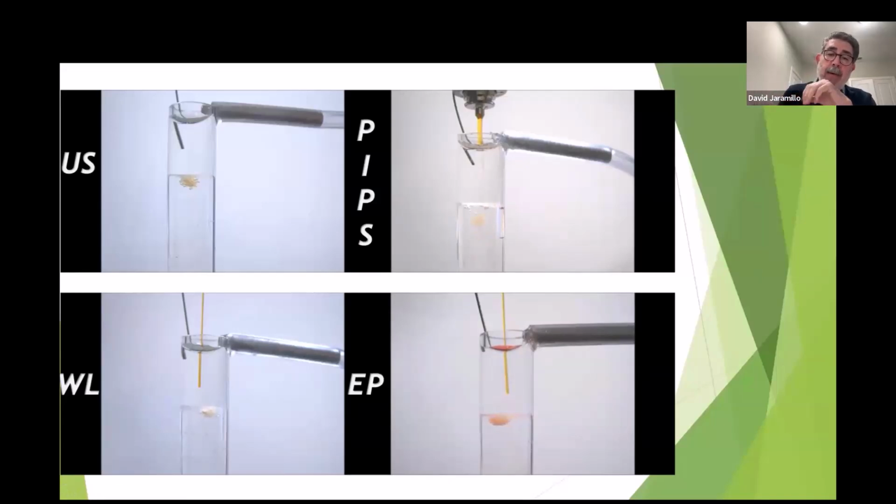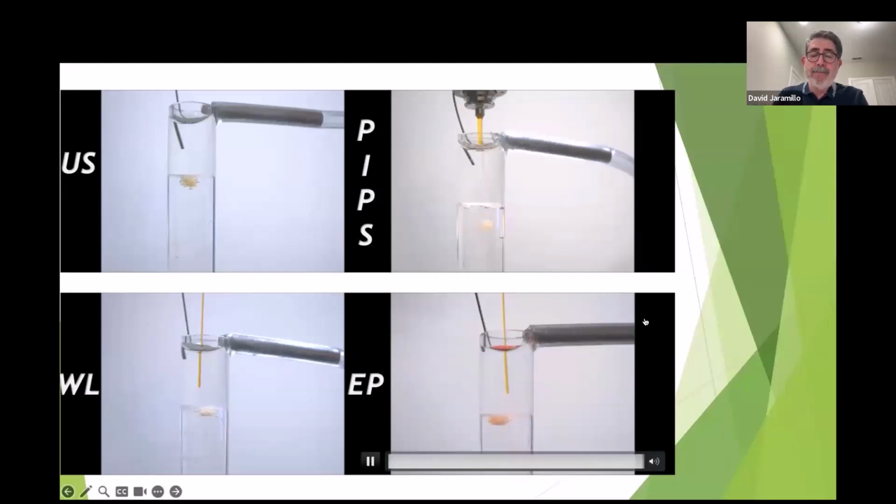Somebody posted a video on Facebook of a glass of water with the laser tip of the WaterLase producing a lot of bubbles. But the tip they use is a very big tip. It's not an endo tip like this one. So it doesn't make any sense.